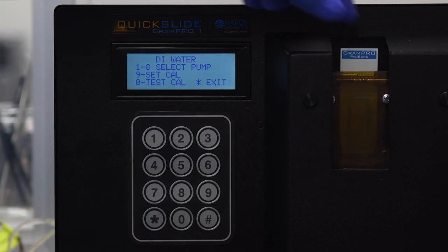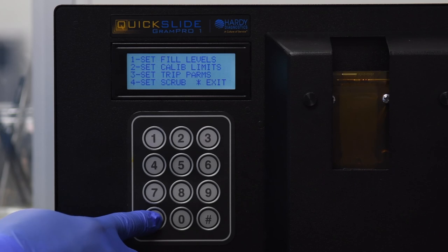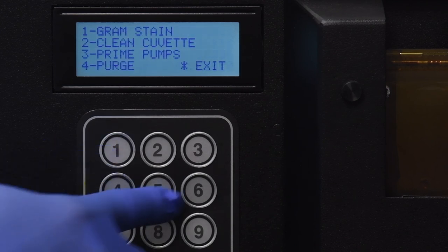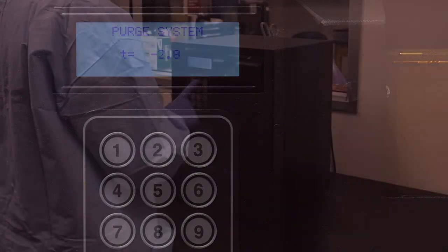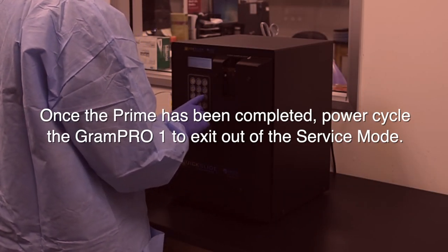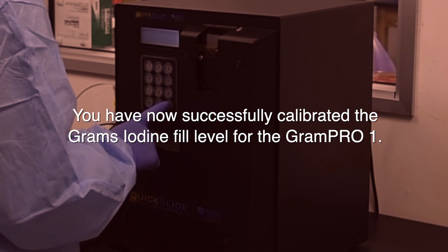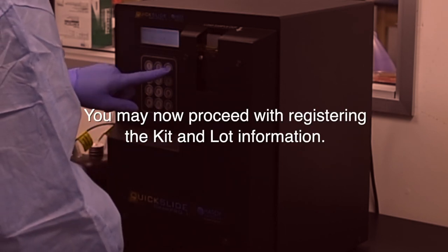You may now remove the slide from the cuvette. Proceed back to the main menu by pressing star to select Exit. Once on the main menu, press 1 to select Run, press 3 to select Prime Pumps. Once the prime has been completed, power cycle the Gram Pro 1 to exit out of service mode. You have now successfully calibrated the grams iodine fill level. You may now proceed with registering the kit and lot information.